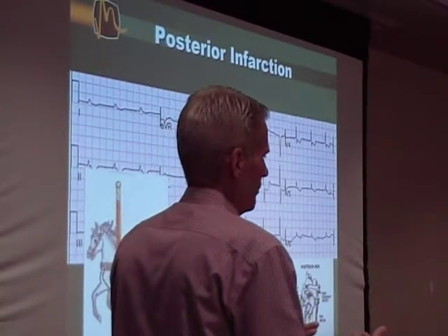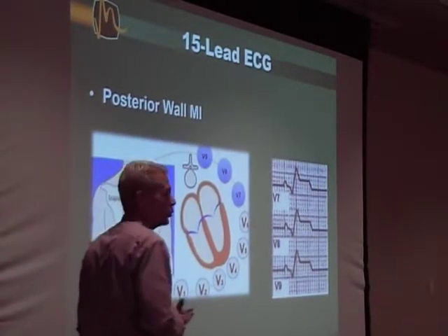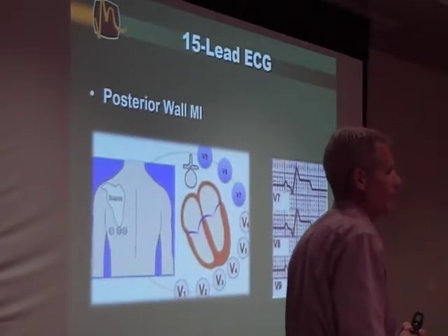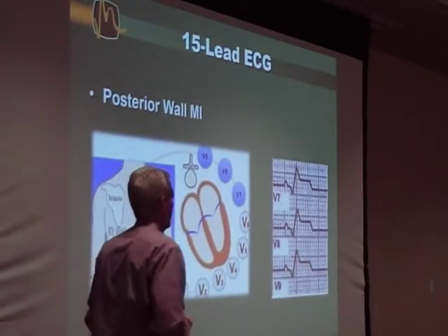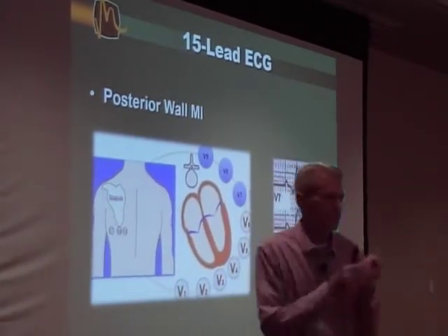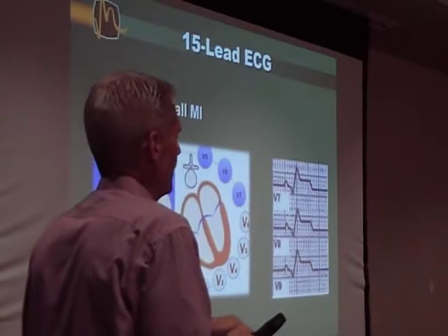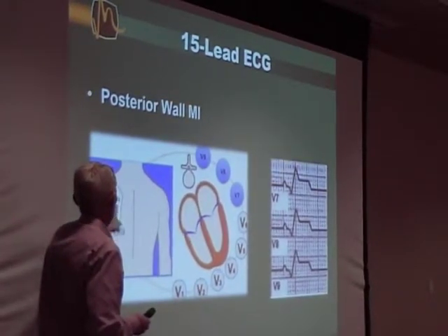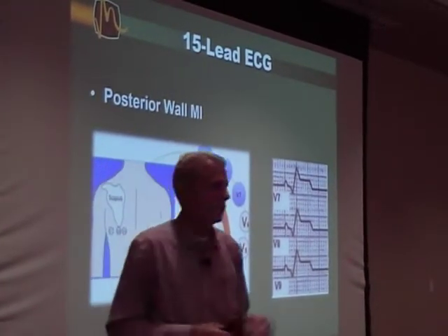Now, advanced stuff, but if you understand what it is you're looking for, and let's face it, if you really wanted to know, you could put patches on your patient's back if you wanted to. There are 15 and 18 lead EKGs. Instead of stopping at V6, keep going with V7, V8, and V9. And then, with patches directly on your patient's back, evaluate for indicative change. And then you can diagnose it straight up. I know some protocols are built for the additional patches. It's not hard to figure out. And as far as placement, V7 is in the posterior axillary line, V8 is right at the tip of the scapula, and then V9 is right along the backbone to the left side. Straight line across.